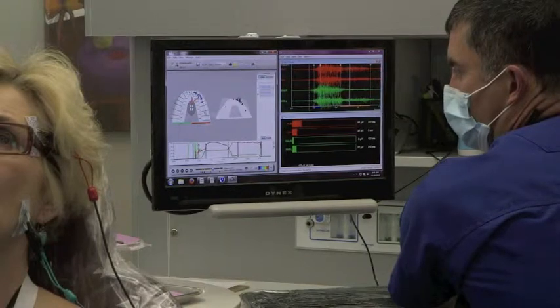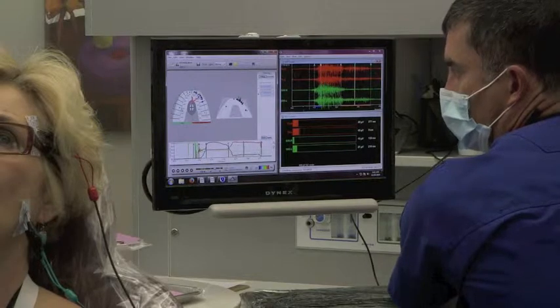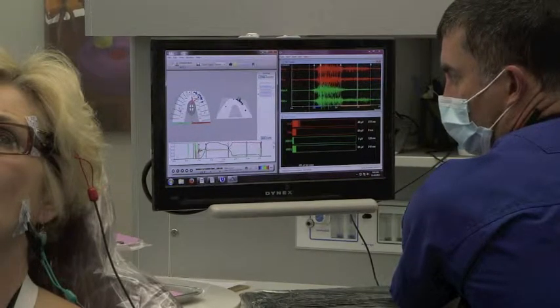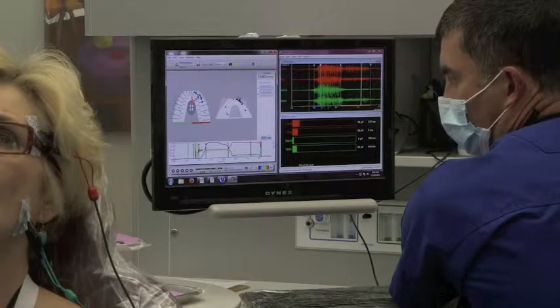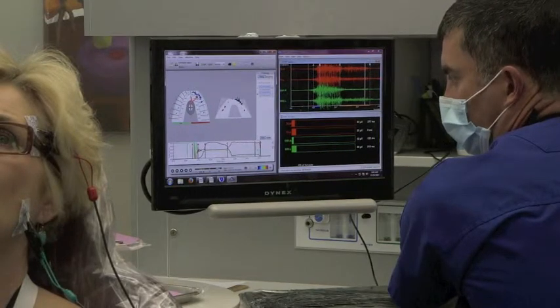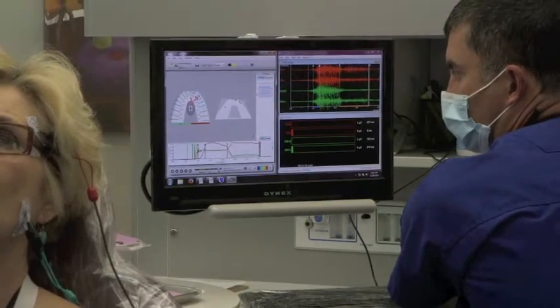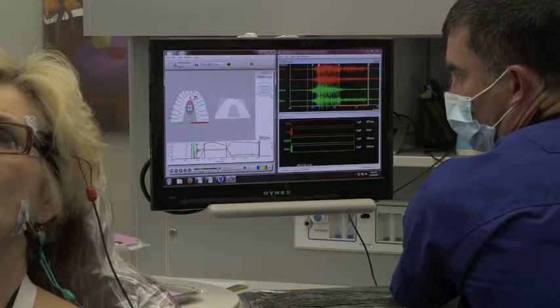Because these back teeth rub continually, that causes the brain to want to make those little rubs go away. So you clench and grind to try to eliminate them. Look at all these things — going over time. See how this is moving? Finally, over here, you're about to separate the back teeth. That's the point. And it took you 1.37 seconds to do so.